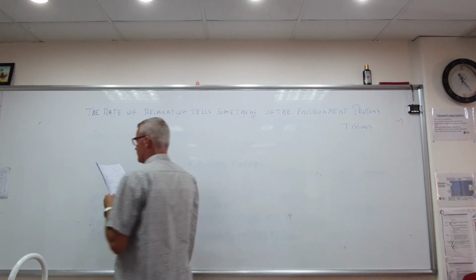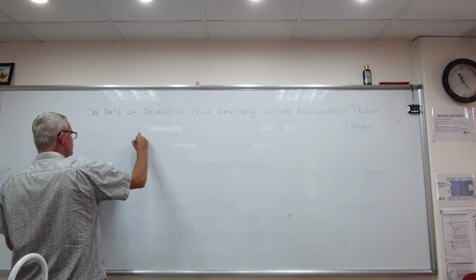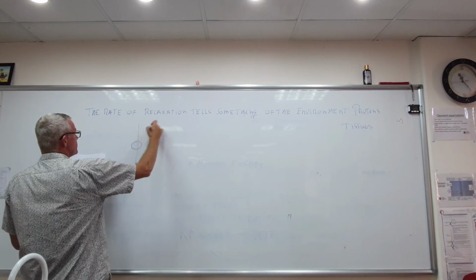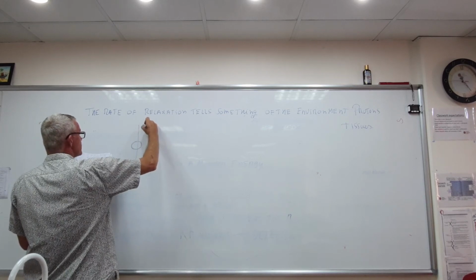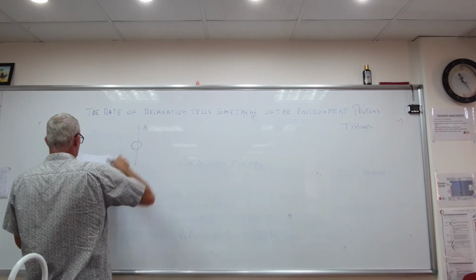So let's have again our proton spinning around. Then we get first phase when a radio wave comes in. We get resonance.